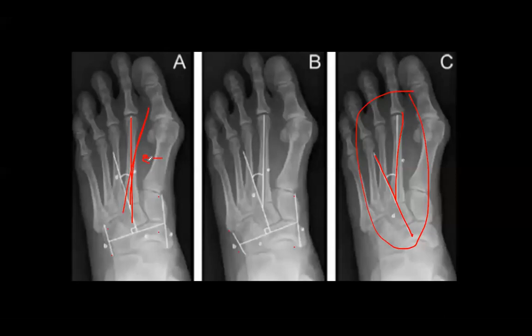So you just have to factor that in your pre-surgical planning. Just out of interest, do you address the metatarsus adductus? Not routinely, unless it's going to prohibit the first metatarsal from getting where we want it to be. But usually I stay away from it. I know some people like to address it all the time. That's just my preference, though. Okay.